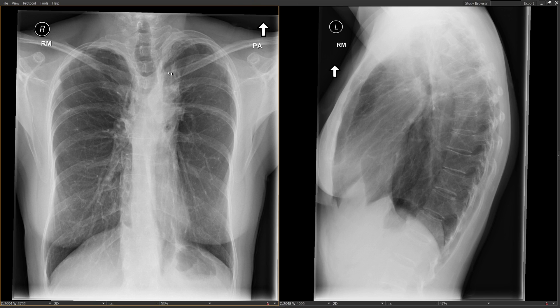Because the lung adjacent to the mediastinum is not completely air-filled, the borders are going to be fuzzy — you have something of soft tissue density touching something of another soft tissue density. In this case, we have the aortic arch here, which we can see, but it's not as well defined as it normally should be because you have this fibrotic lung right next to it. The same is true on the other side — the borders of the SVC are not as well defined as we normally have them.